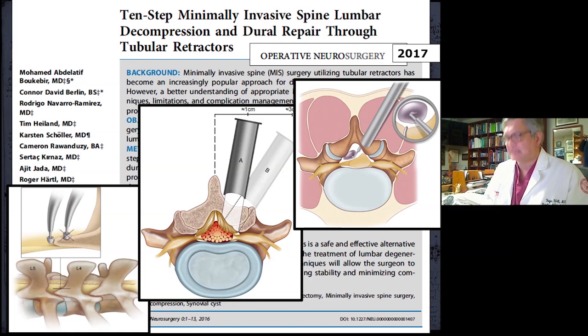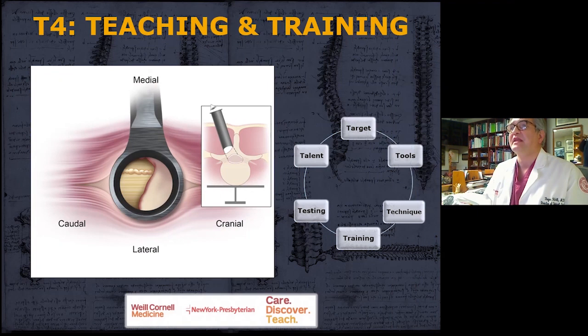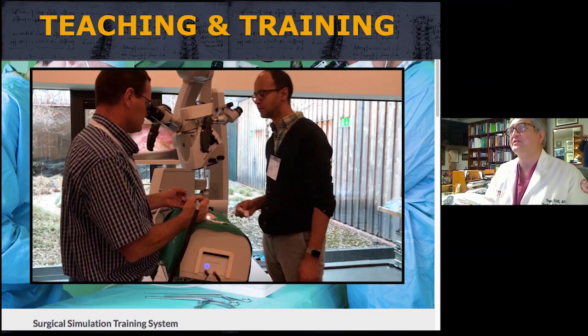And so this was all written up. And this kind of is my introduction into the other T, which was teaching and training. And this becomes so important, especially when you talk about tubular surgery, how to use the drill, how to use navigation, because a lot of surgeons don't have really that experience.